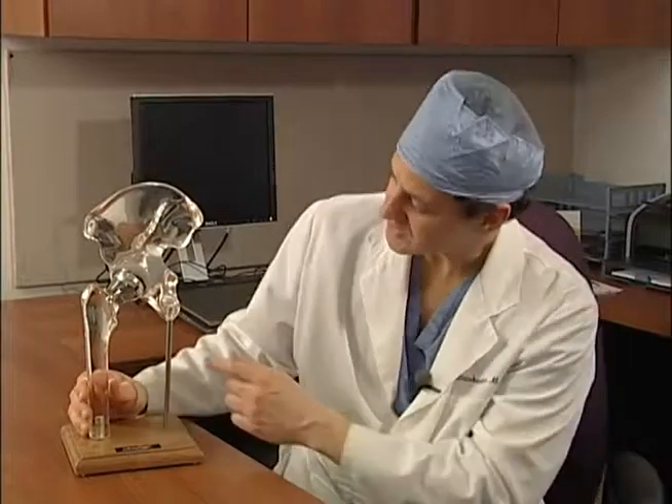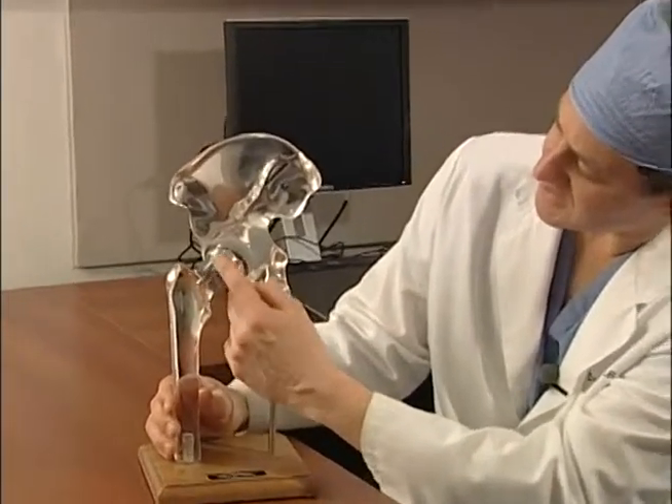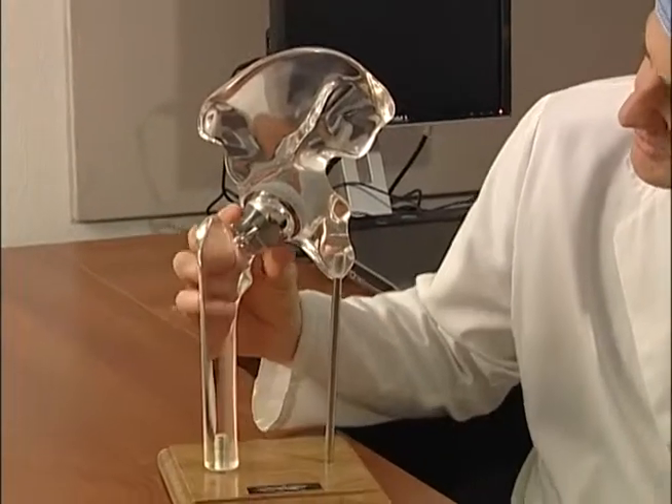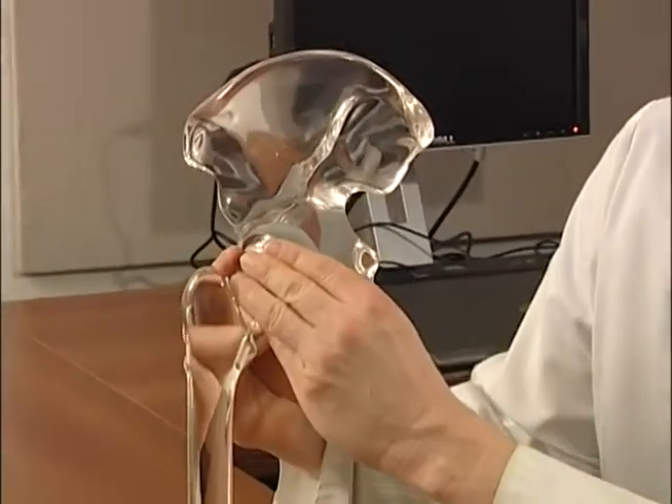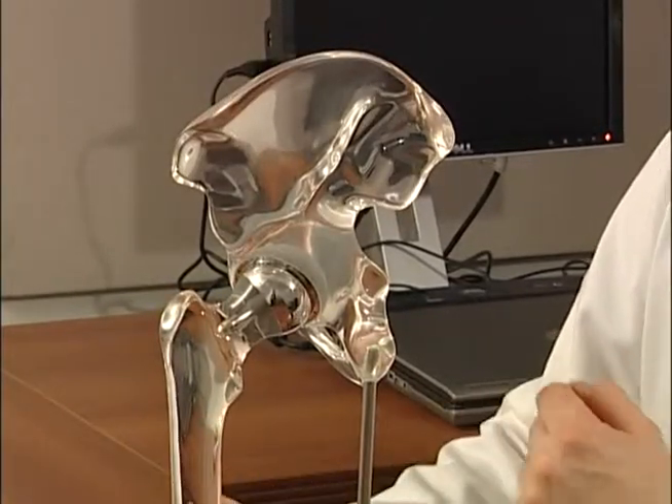So the more bone we start with in a young patient the better. You can see in the hip resurfacing we retain all of this femoral neck and the femoral head underneath this ball, and in a hip replacement all of this bone is taken away. So this is one of the great advantages for a younger patient.